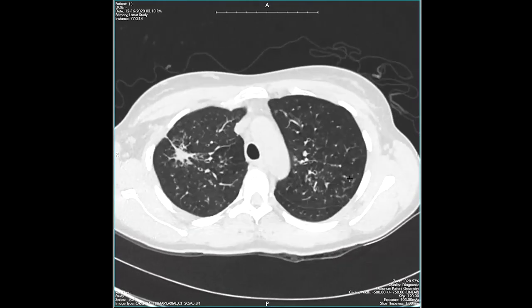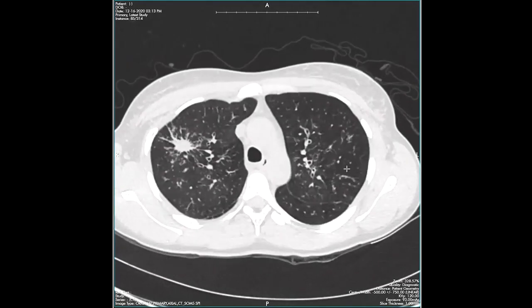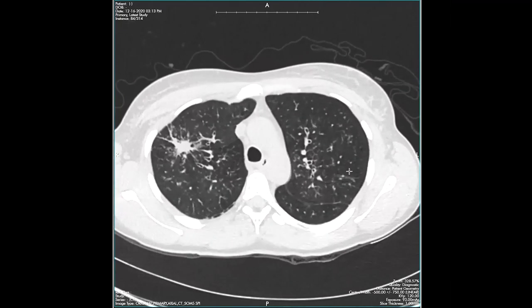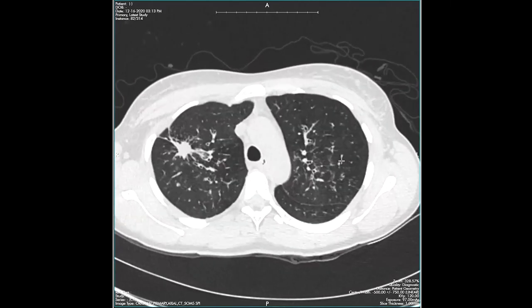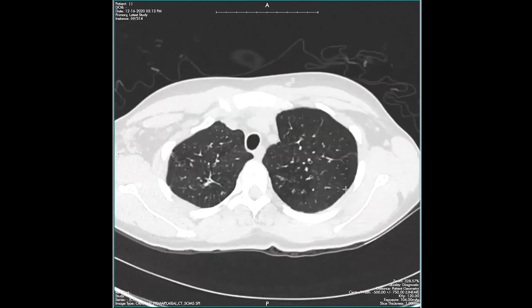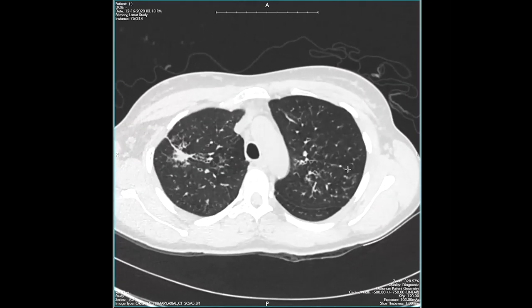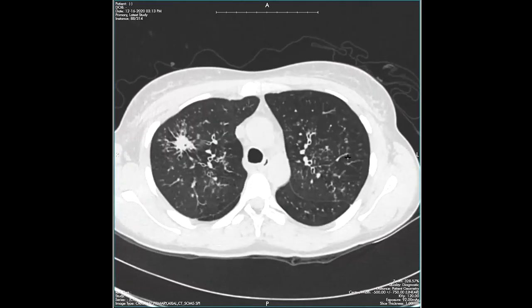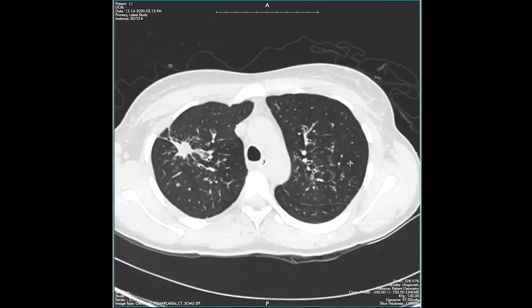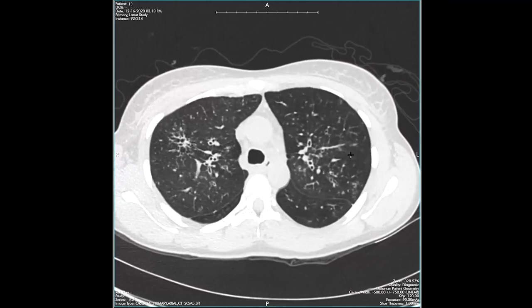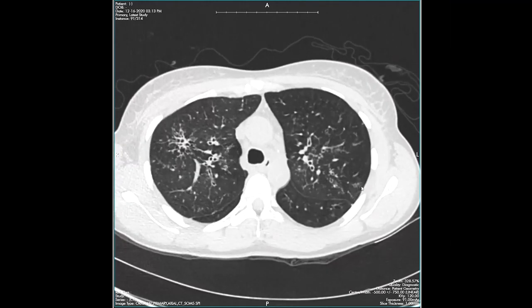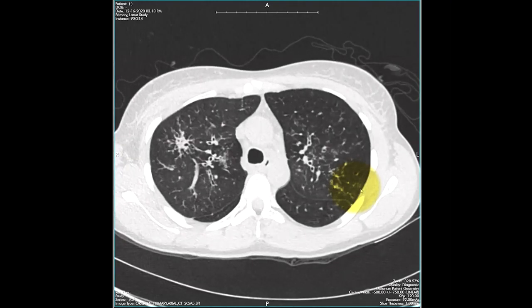So how would we characterize these nodules? At first glance, you'd see that these nodules are solid and well-defined. That can really be seen with either miliary, perilymphatic, or centrilobular. So it's not particularly helpful. Some of these nodules do appear to be sparing pleural surfaces, like in this area here.